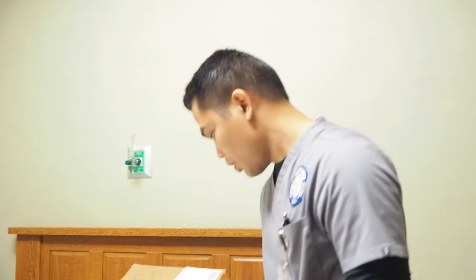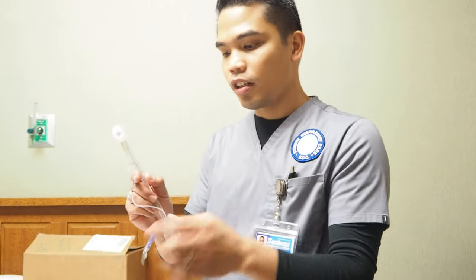Once everything is done, make sure we reassess the patient. Check the ET tube if it's still in place, the balloon cuff if it's still inflated. Listen to the breath sounds so that we're able to check if there are still adventitious breath sounds or if it's been cleared up. Also check the vital signs.